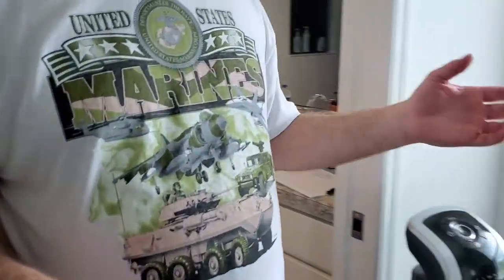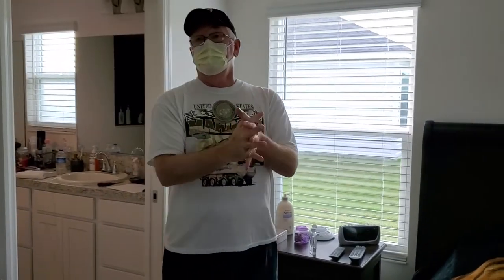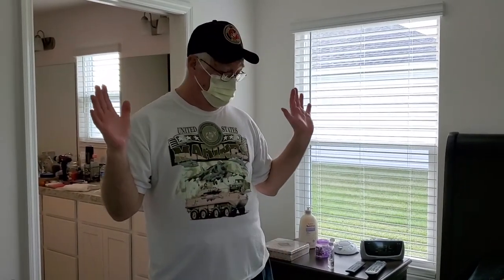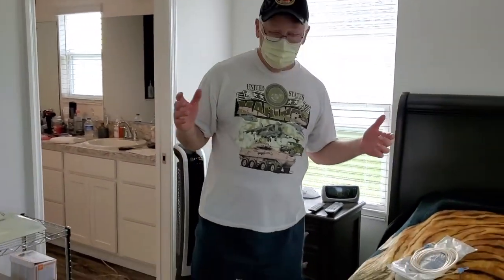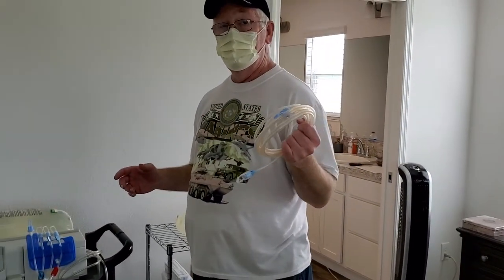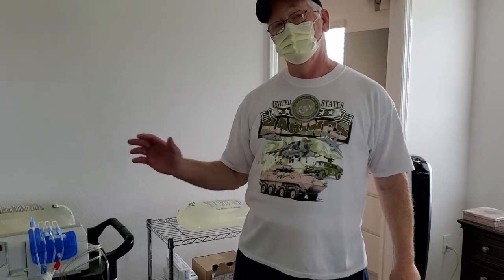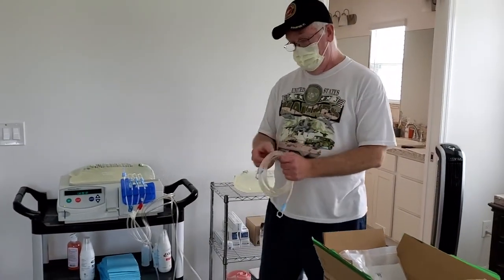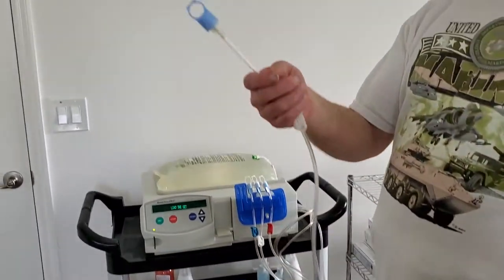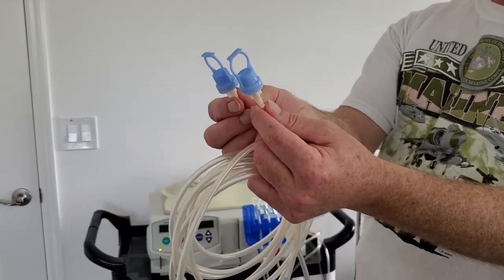Just in case I touched anything I wasn't supposed to between the bathroom and coming back in here, I'm re-sanitizing my hands. Now this is the part about the 12-foot patient extension line. If you don't have it, don't worry about it — right now you'd just hit go and it'll start performing a self-test. But since I'm using it, I want to show you: make sure the connectors match — you can see how those match. That's what you want, make sure you're hooking up the right one.